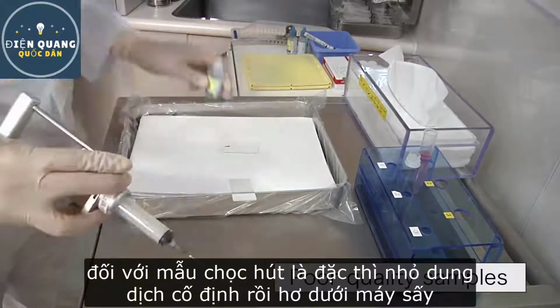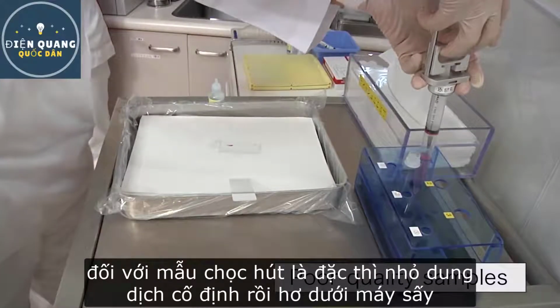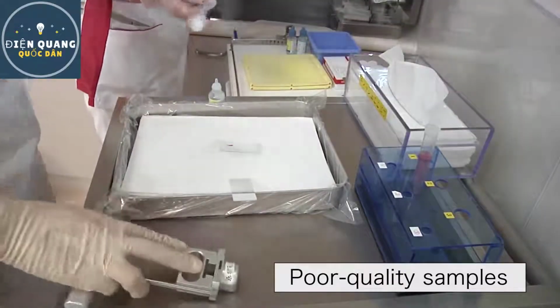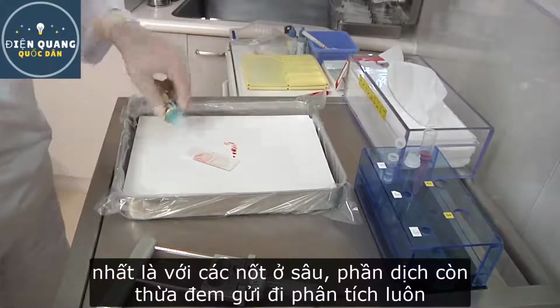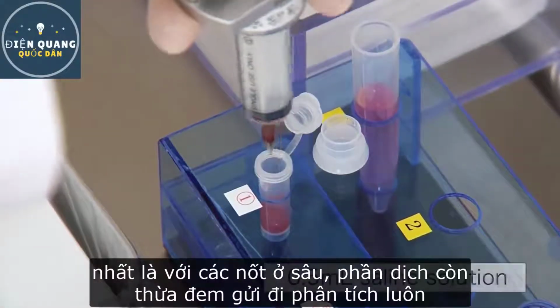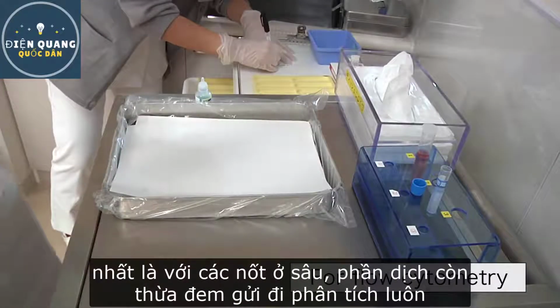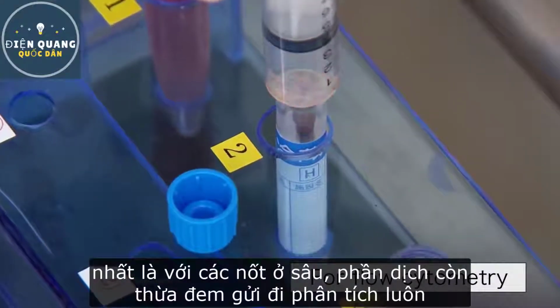For poor quality samples, the fixation should be immediately performed without smearing to prevent the drying artifact. Biochemical measurement using needle washout fluids may be more useful than aspiration cytology. When we aspirate the lymph node, we usually measure the thyroglobulin using the needle washout fluid. When lymphoma is suspected, we employ flow cytometry using the aspirated materials.